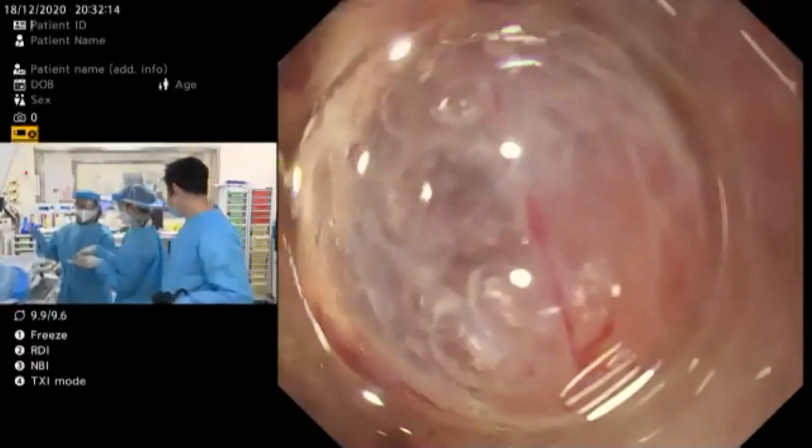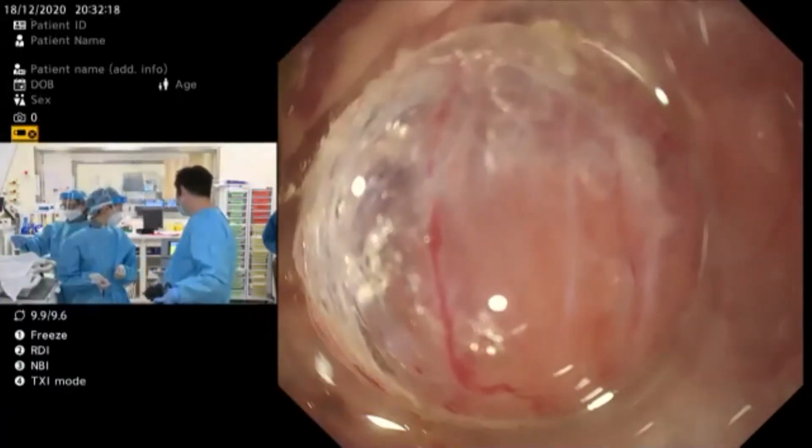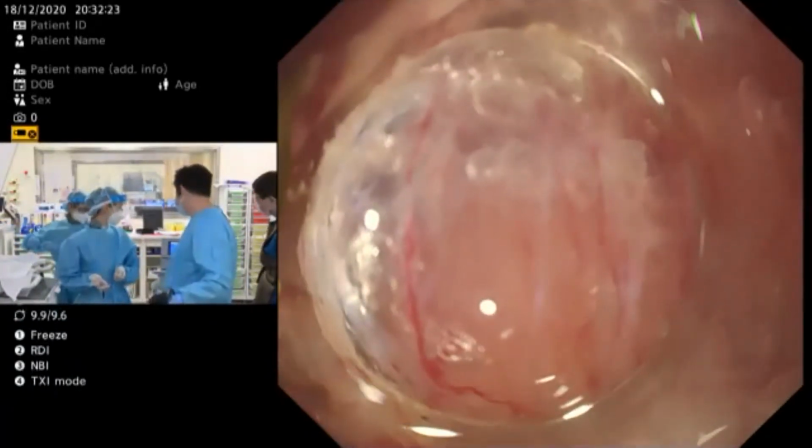Sometimes if you are patient enough, if you're using the needle type knife, there's a mode that you can use. It's called 110 mode, proposed by Professor Toyonaga.